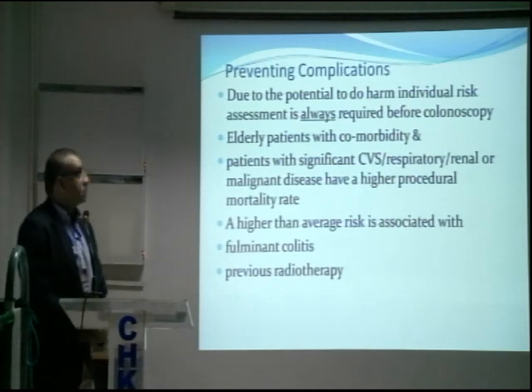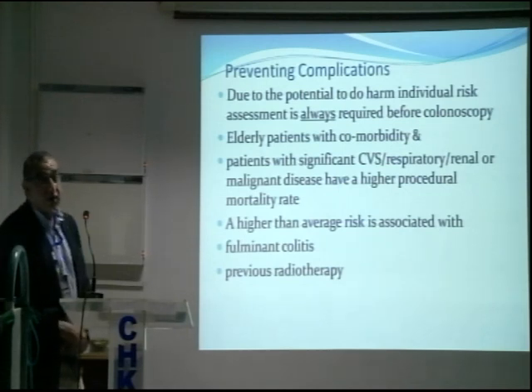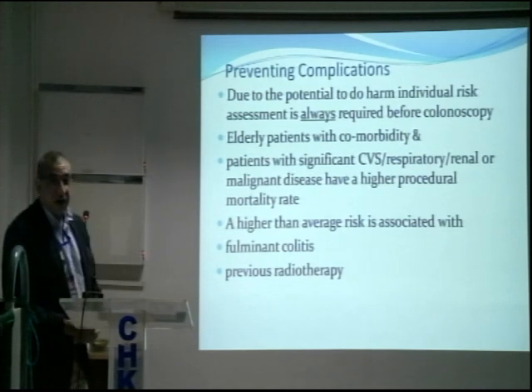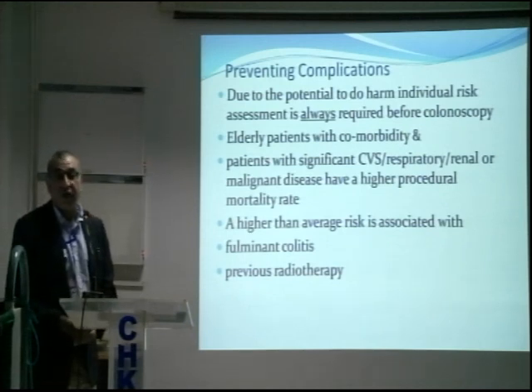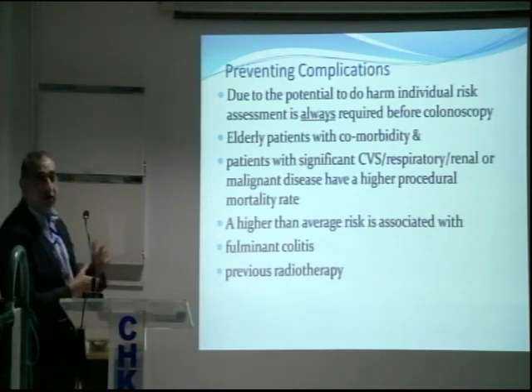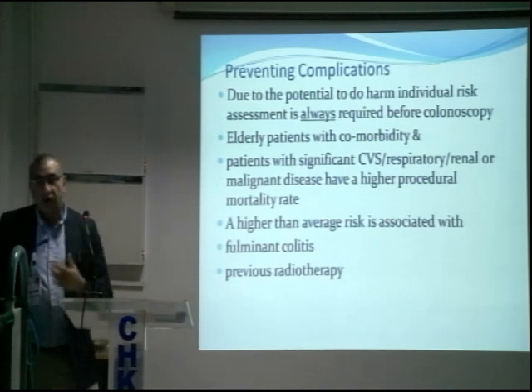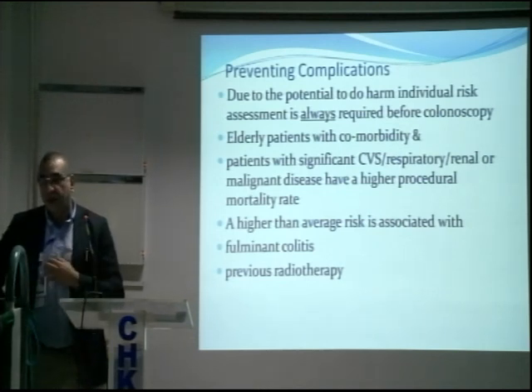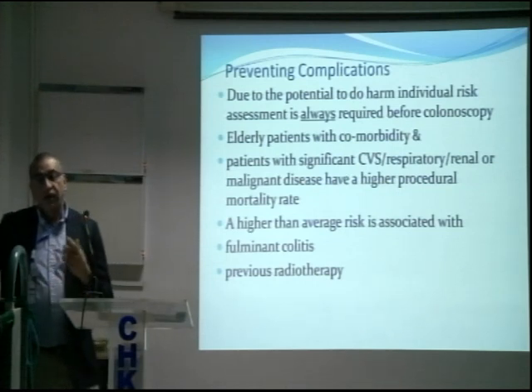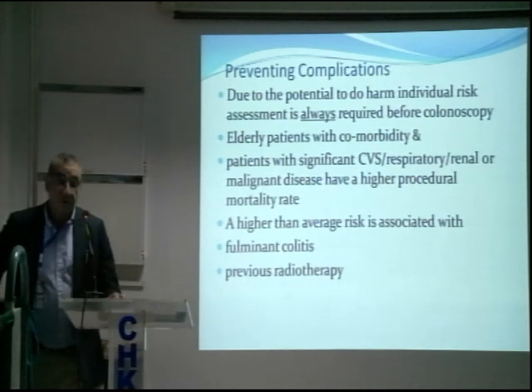Preventing complications. First of all, always assess the patient beforehand. Look for comorbid factors. Especially elderly patients with significant cardiovascular or respiratory problems, or malignant disease, have a higher procedural mortality, and conditions like fulminant colitis or a previous history of radiotherapy carry a higher risk with the procedure.